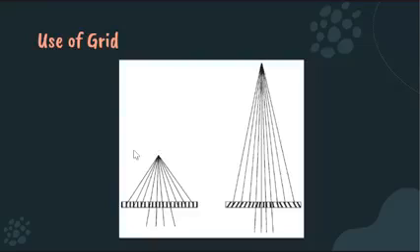Okay, grid cutoff happens when your X-ray beam is closer to the grid than expected. So what happens is that when the X-ray tube produces X-rays here in the primary beam, it can no longer pass through the grid. Therefore, there is cutoff of the primary beam in these areas at an oblique angle. Okay, so as you can see, only small parts of the primary beam become the remnant beam. Because of this, there is cutoff by the grid of your primary beam. Therefore, it is called grid cutoff, which will result in this image.